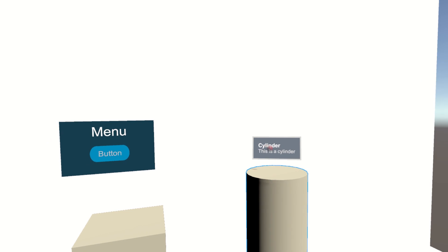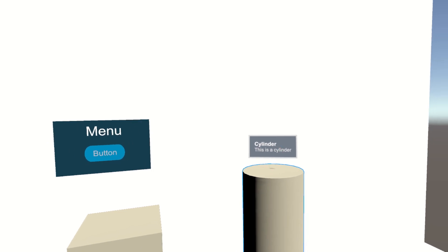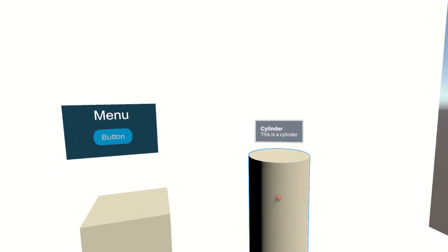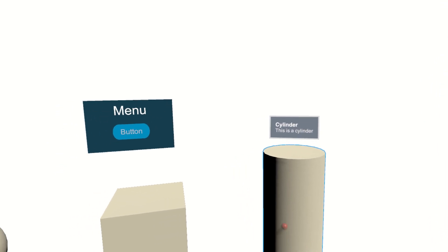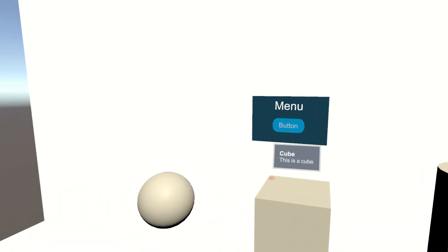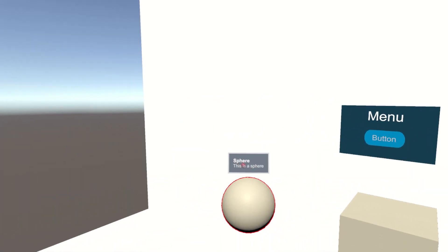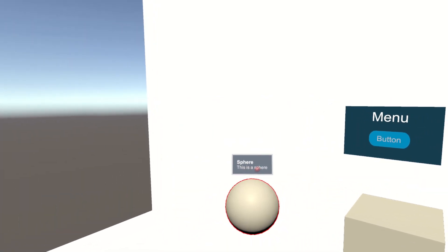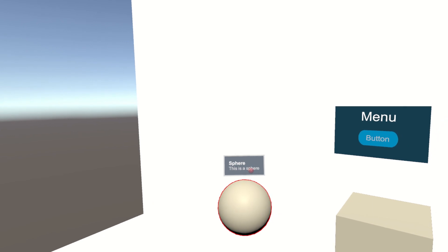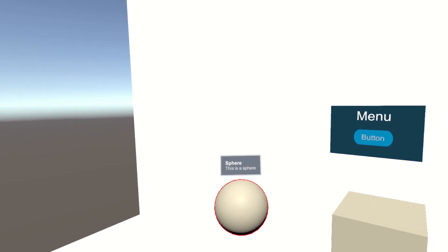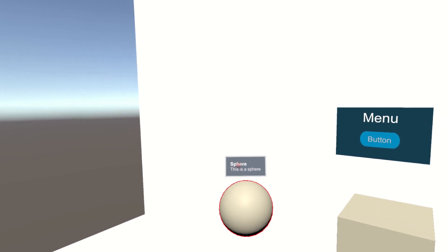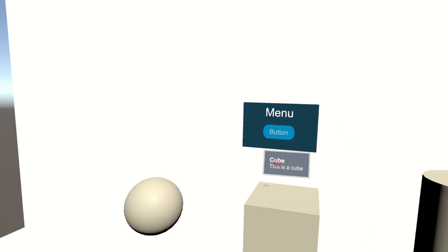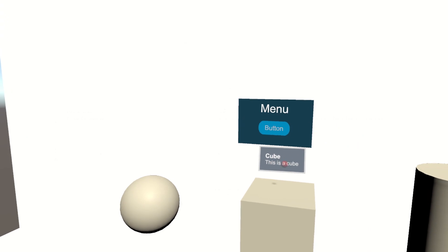The gaze point is indicated by a red ball in the graphical interface, appearing when the objects are gazed upon. You can notice the gaze point fall on the words when the info text of the object is read. In future systems, we can use real-time analysis of gaze patterns to automatically confirm when a training instruction has been read by the patient.